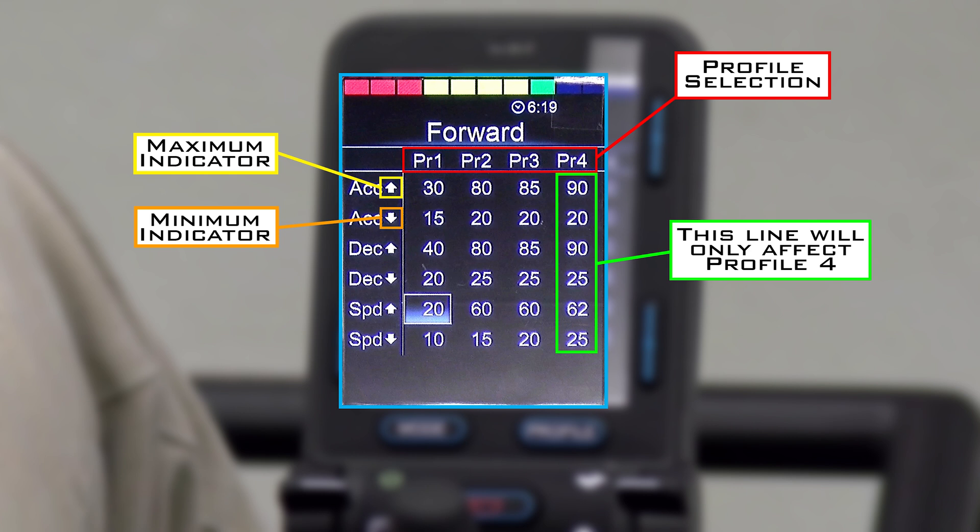I wanted to go over the programming screen. You can see on the top we have the profile selection highlighted in red. Each one of those columns will only affect that profile. So you can see on the right we have the green rectangle — all of those settings will only affect profile 4. On the left side you can see we have the maximum and minimum indicators. The up arrow is a maximum indicator and the down arrow is a minimum indicator.